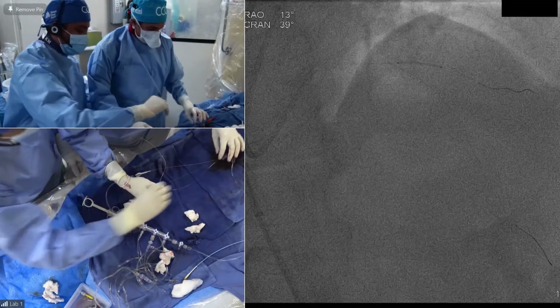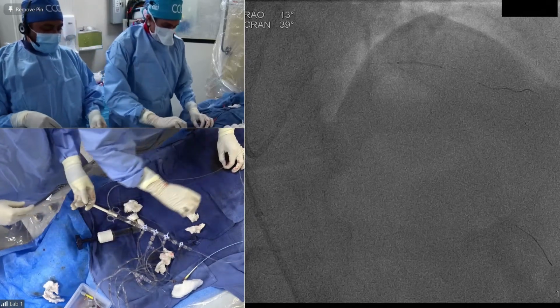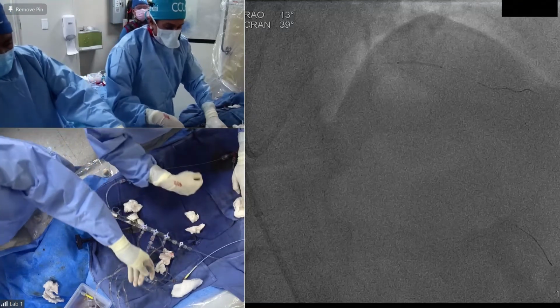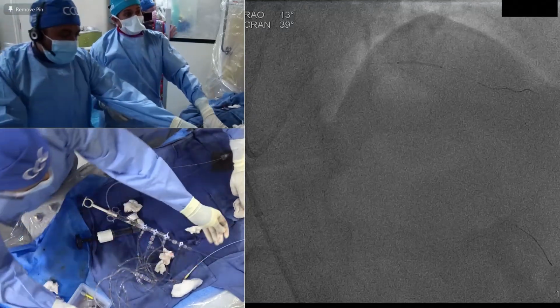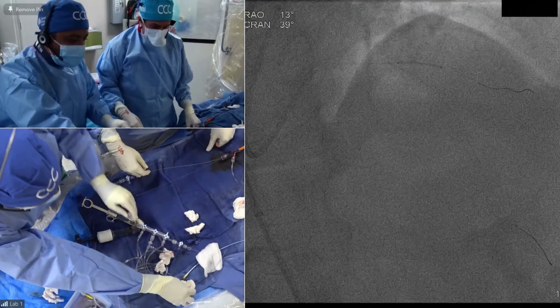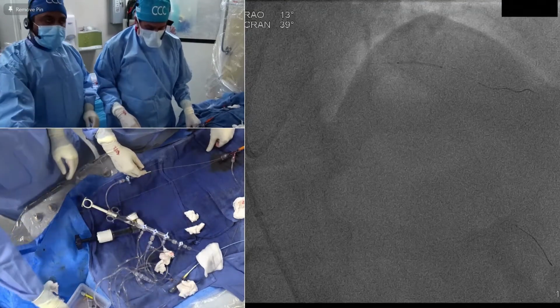Yeah, 3.5 by 24, yeah. One other approach is we can do a step crush. The other thing we can do is a step crush. Dr. Waxman was to further complicate this case. It wasn't complicated enough for him. So he says, forget what we're doing right now.